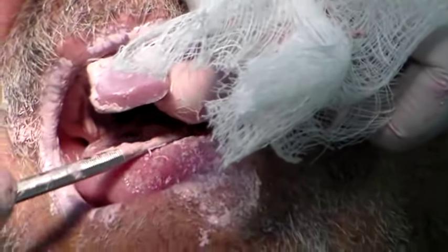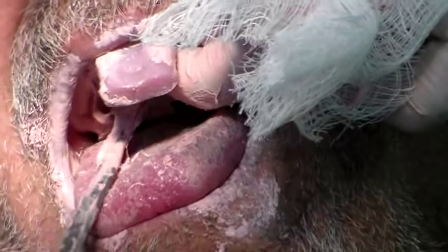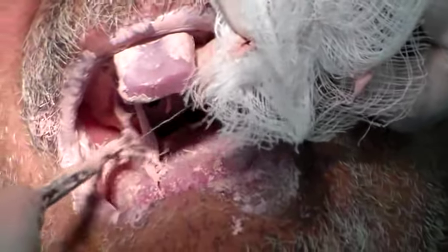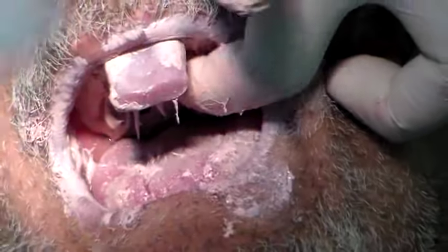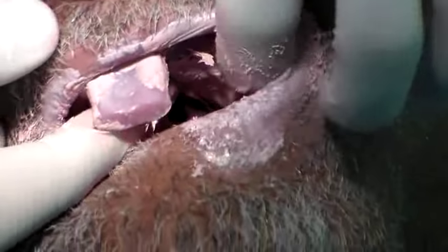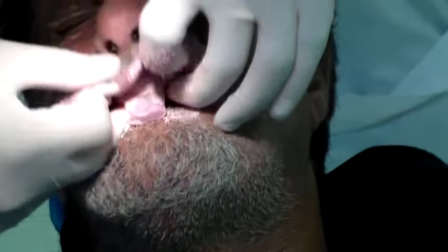So that the patient is not struggling anymore. I am just trying to take off the material that was flowing into the palate. I am going to leave this aside and come back to my molding. Make sure I get my frenum.